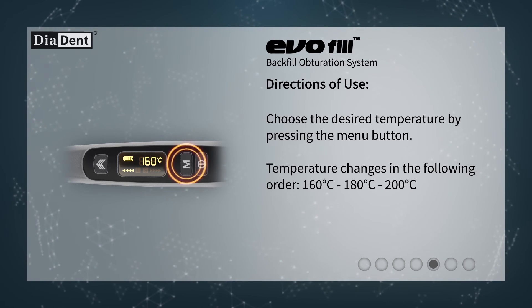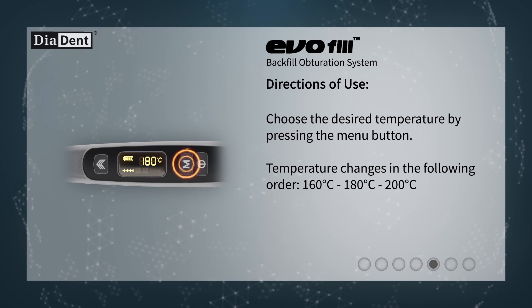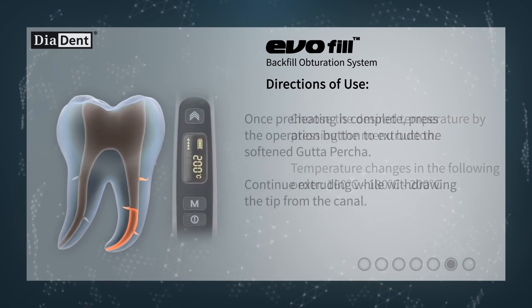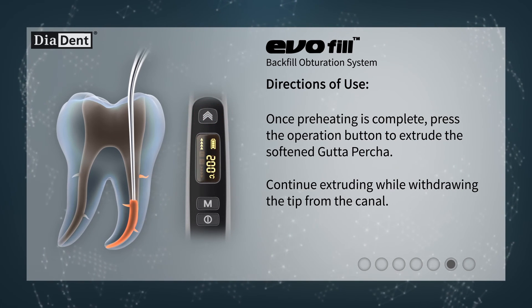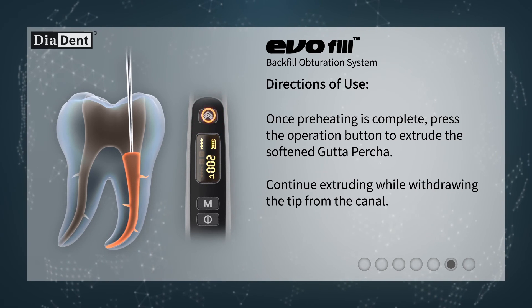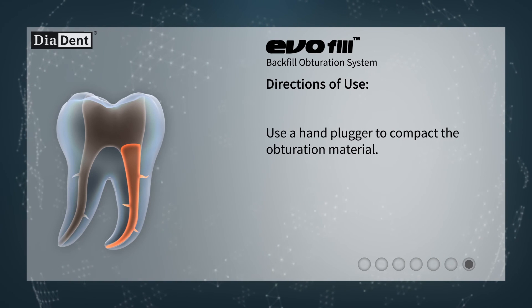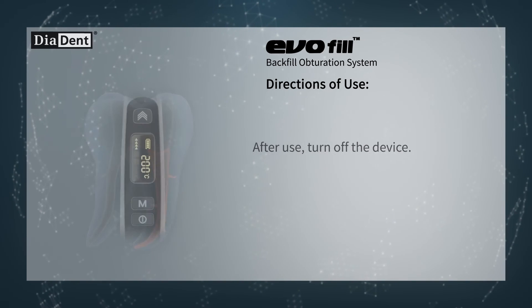Choose the desired temperature by pressing the menu button. Temperature changes in the following order: 160 degrees Celsius, 180 degrees Celsius, 200 degrees Celsius. Once preheating is complete, press the operation button to extrude the softened gutta-percha. Continue extruding while withdrawing the tip from the canal. Use a hand plugger to compact the obturation material. After use, turn off the device.